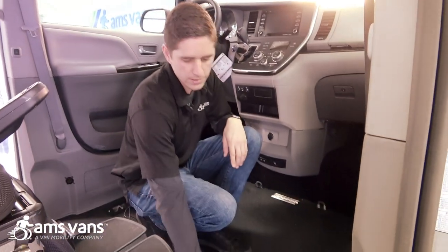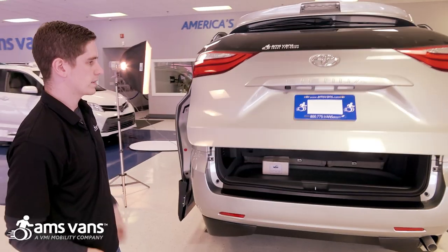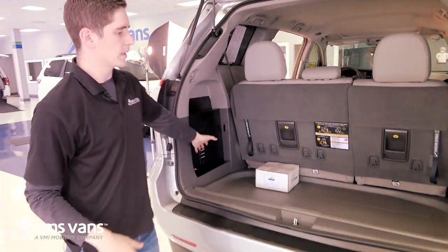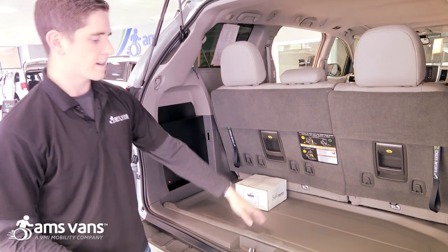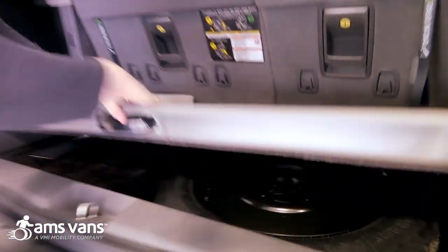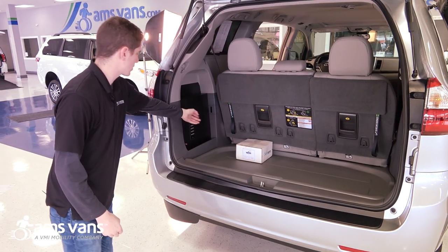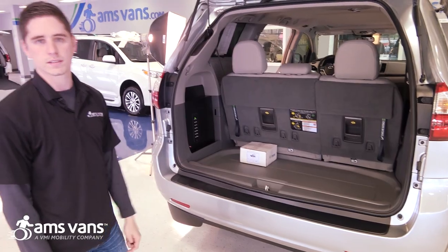You've got the L-tracks here for the mid-row position as well as front passenger. We're going to take a look at the cargo space on the conversion — there's plenty of space here to store groceries, boxes, whatever it may be. The spare tire is actually neatly tucked away underneath this panel right here, so you'll be able to access it should you ever need it. You've also got your ramp controls right here, so it's going to be easy to diagnose anything on the conversion as well.